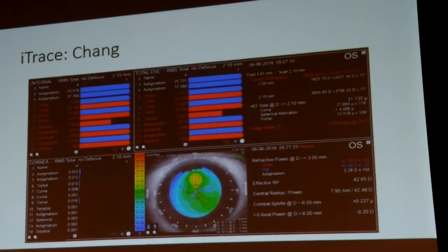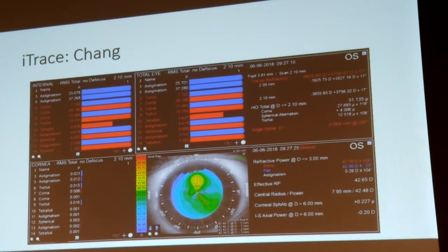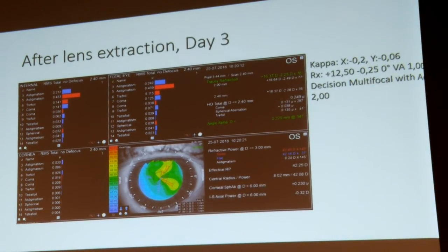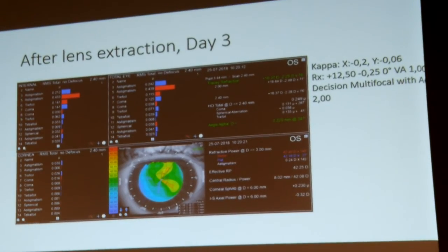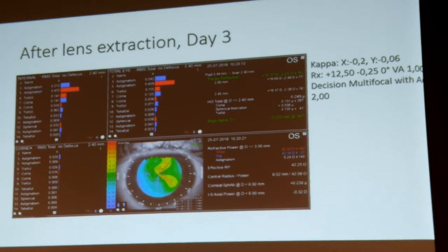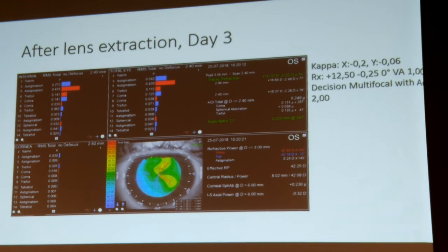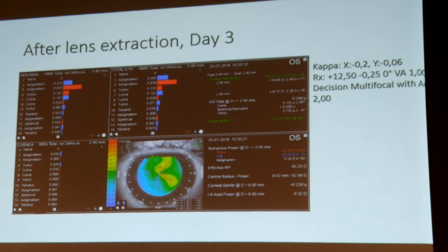But we decided to do it another way, and that's the eye trace, clearly looking down. So what we did is we did just the lens extraction. Professor Meyer performed the lens extraction. Then 3 days after surgery, we did the first eye trace measurement, and then another 4 days later, we repeated all the axial length measurements. We looked at the retina, we did the OCT scan, everything, and oh, this eye is perfect.